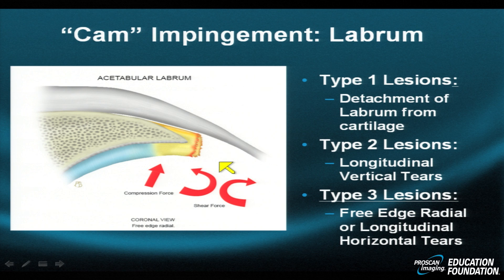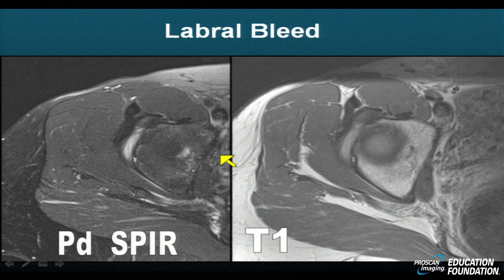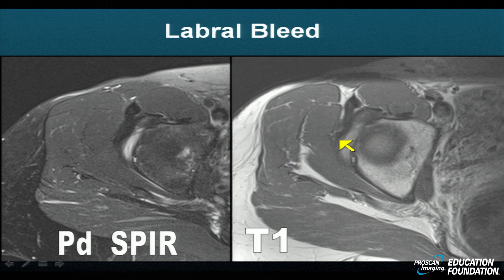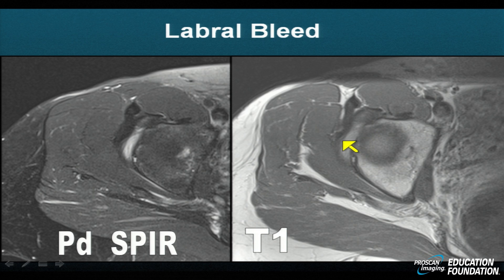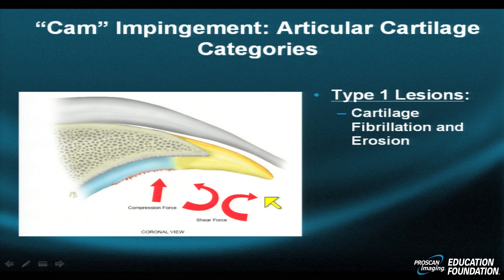In type 3 lesions, the tip of the labrum is truncated or lost — the so-called free edge or radial tear. Here's an example of a patient who was using kettlebells for exercise and has amputated the free edge of the labrum, now replaced by a large collection of blood. The entire labrum from anterior to posterior is represented by T1 hyperintense signal abnormality, with perhaps a little labrum remaining anteriorly.